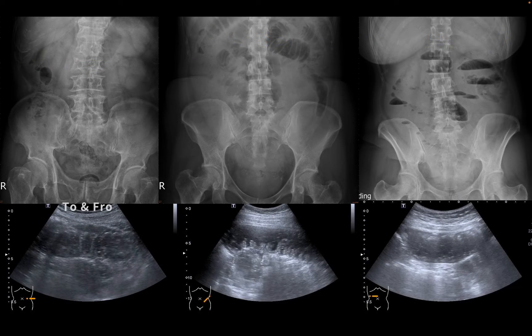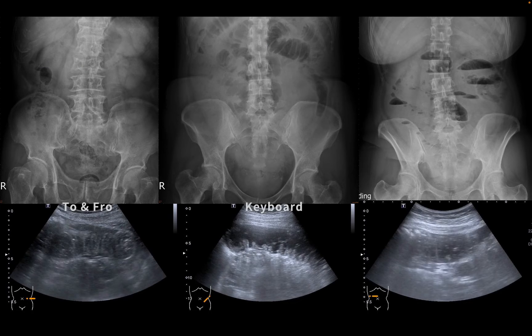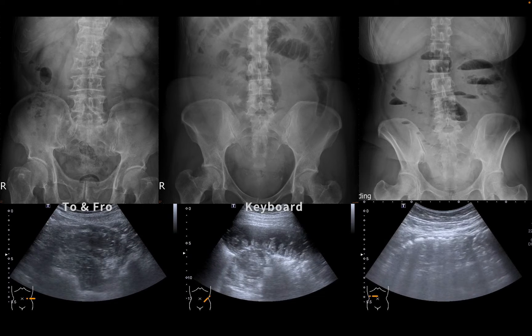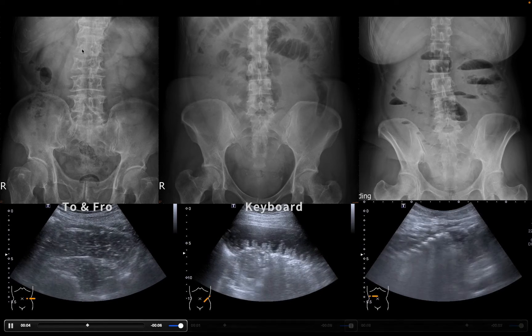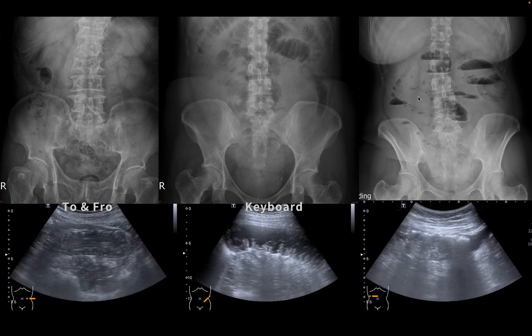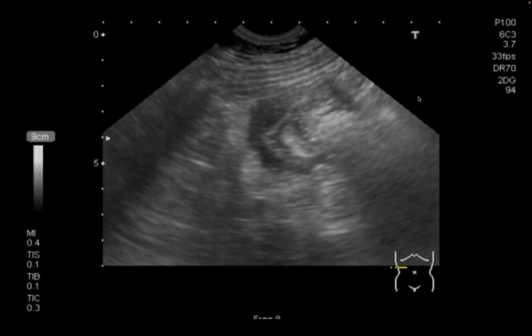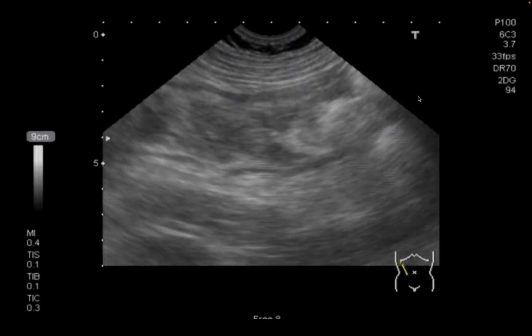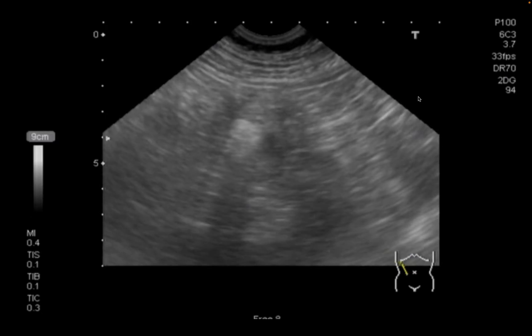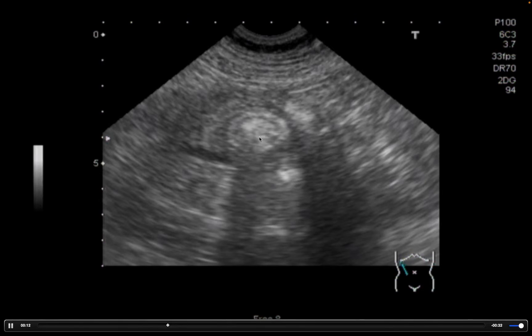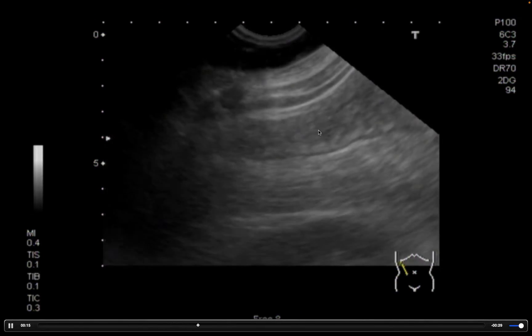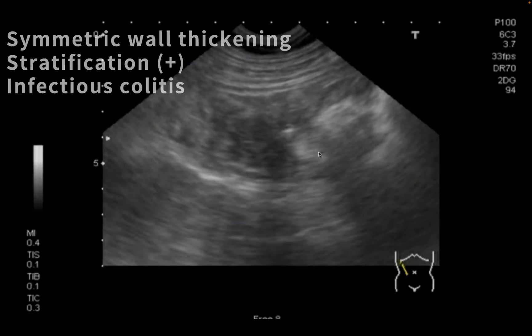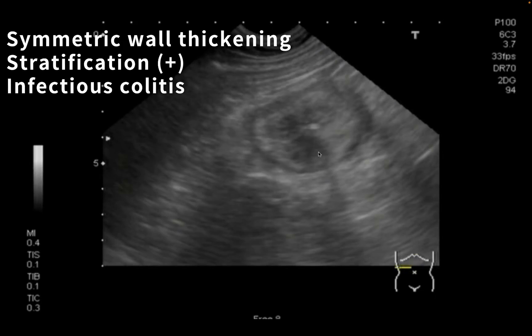We use three pairs of x-rays and sonograms in three different patients. For the ultrasound, it is useful to diagnose ileus rather than the other two patterns. When the bowel wall is thickened, we have to recognize its structures. This patient having fever and abdominal pain — we can see the ileocecal valve and the whole structure is actually the ascending colon. The wall is thickened, stratification preserved, and it is coming from a patient having infectious colitis.